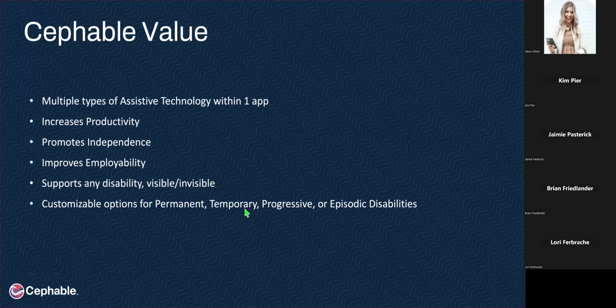One more individual use case that I think is really interesting is one of our adult users. He has cerebral palsy and has the ability to press one key on the keyboard at a time holding a pencil. He loves that ability, but he's added Cephable voice controls on top of his ability to press a single key at a time using his pencil, to increase his independence with playing more games and his productivity with his job.